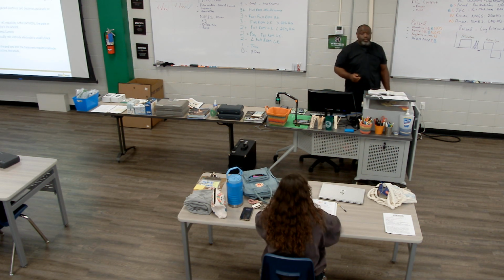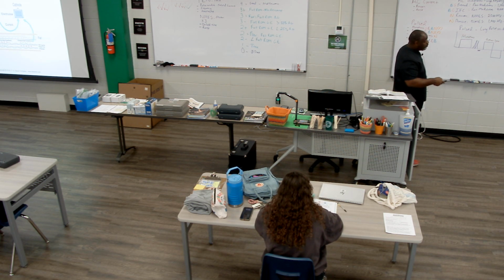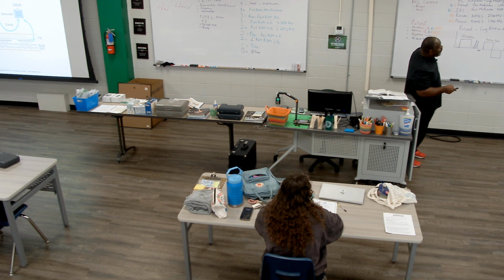Yes, so underneath the skin, what's happening is we have flow of charged particles. So these are our electrodes that are connected to our body. Flowing between these, we have current flowing from positive to negative. So current flows from positive to negative. And then we'll also have electron flow going that way. So we'll have the flow of charged electrons underneath the skin.